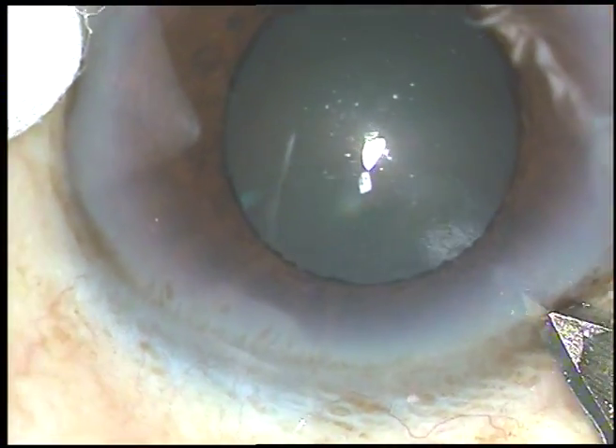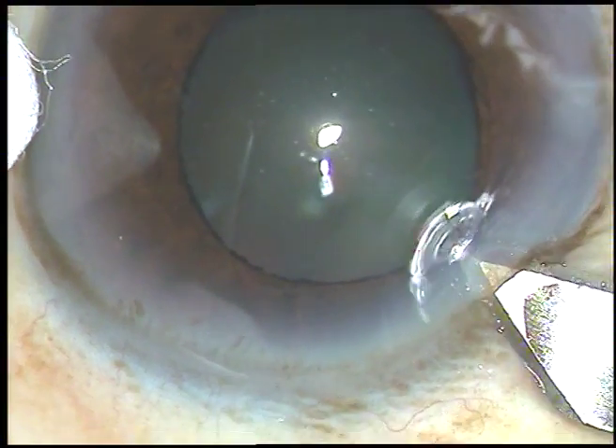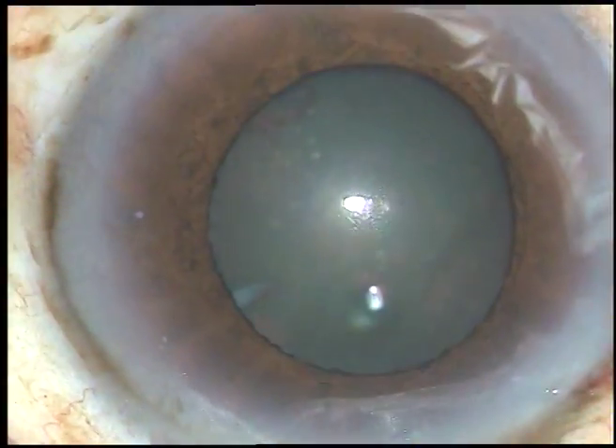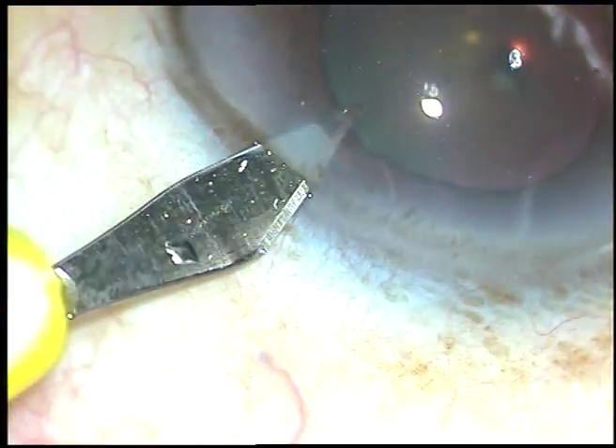In this case, the pupil has not dilated well, and while emulsification of nuclear fragments will be done, the pupil will become very small. Let us see how we can manage this case.